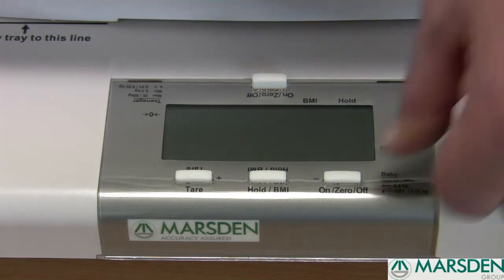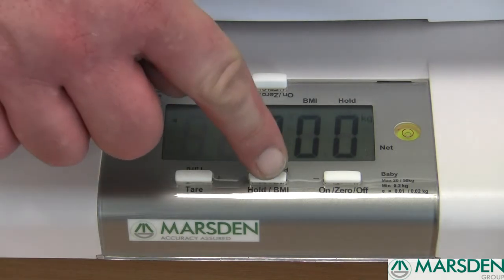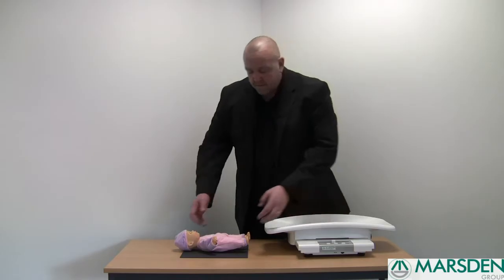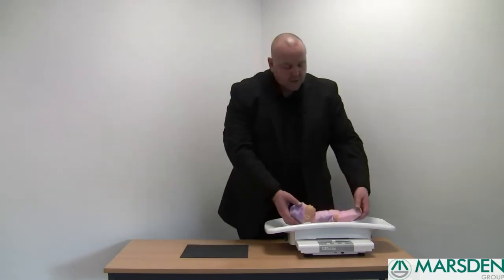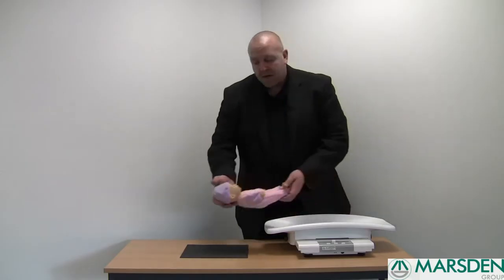The first function of this scale is the hold button. Turn the scale on — the scale reads zero — then press the hold button once. You can then place your baby gently in the scoop. The scale will find the baby's weight and hold it there for you, enabling you to take the baby out of the scoop without causing it too much distress.